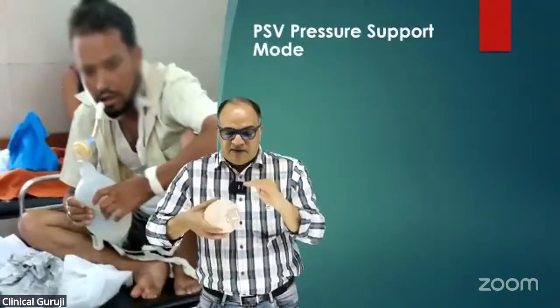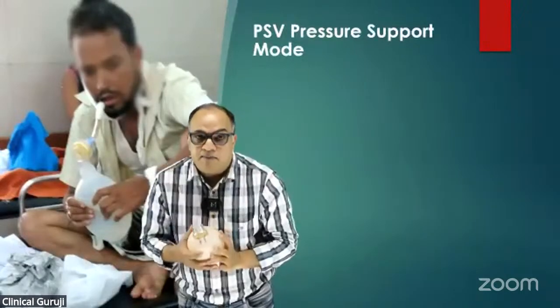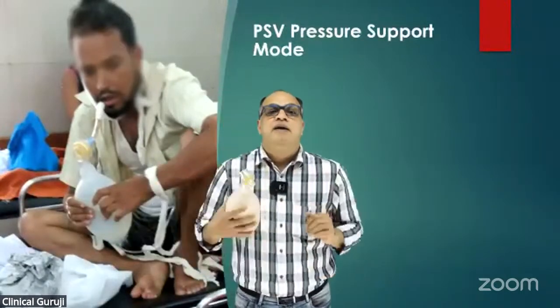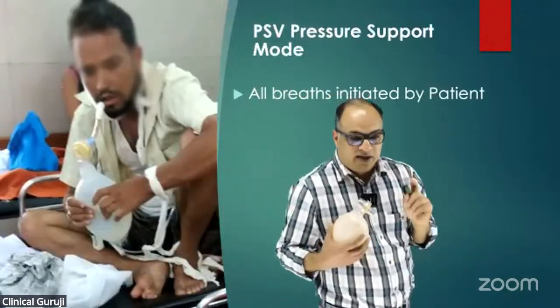Let's say there is a PEEP of 5 constant going on. The ventilator has been told to give a pressure support of 15. So what will happen? The ventilator will wait. Whenever the patient triggers a breath, it will increase the pressure in the airway by 15. Every breath, it will increase the pressure by 15. That's it. How much tidal volume will be generated? That will depend upon how much effort the patient made. Right? So each breath is generated by the patient only, first and foremost thing.